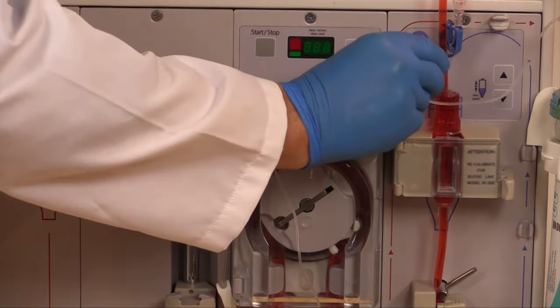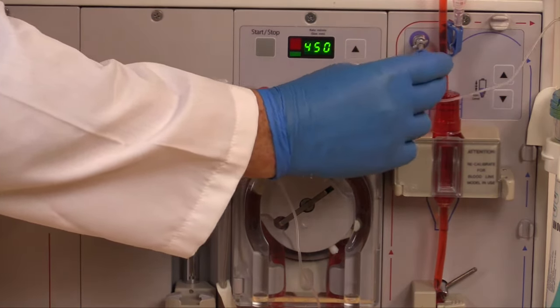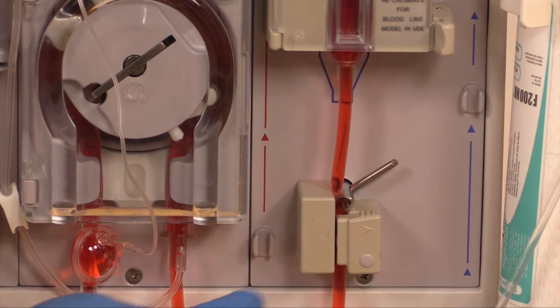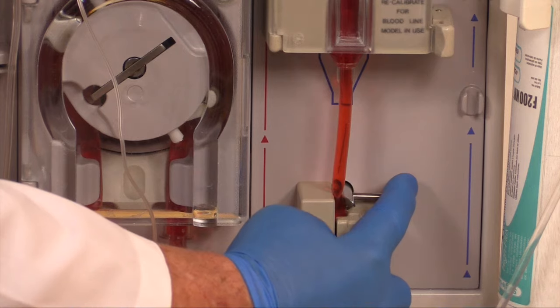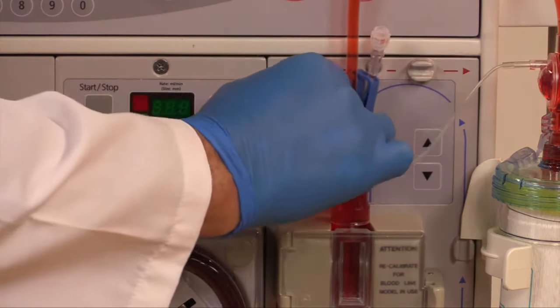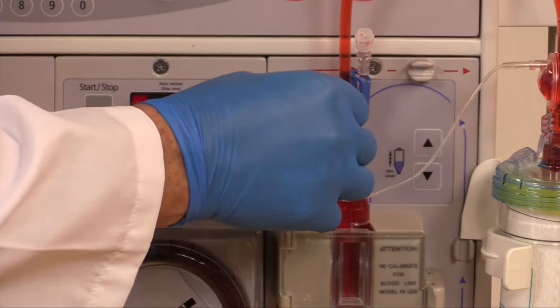Close the venous monitor line clamp. Reset alarms and ensure the main venous tubing clamp is open. Disconnect the monitor line from the venous pressure port.